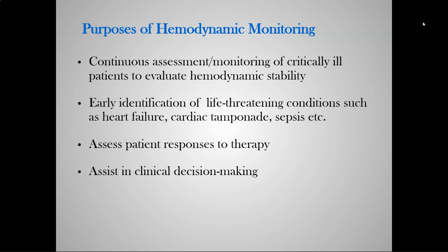So why do we do it? Just straight up, why? What is the purpose of hemodynamic monitoring? Okay, we can already monitor heart rate, we can already monitor blood pressure. Why do I need to go and do anything more? Well, hemodynamic monitoring is an incredibly useful tool, especially when it comes to the treatment of patients that are acutely ill, severely ill, especially in the states of sepsis, anaphylaxis, any kind of neurogenic shock, anything like cardiogenic shock, obstructive shocks, hypovolemic shock, pretty much your four main shocks.